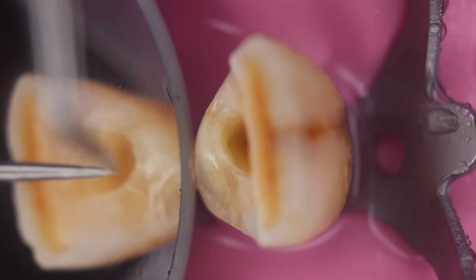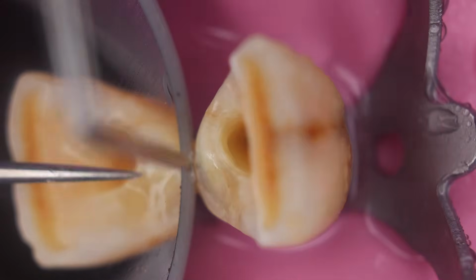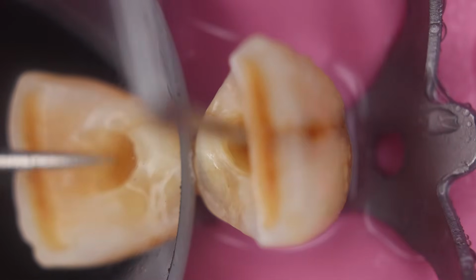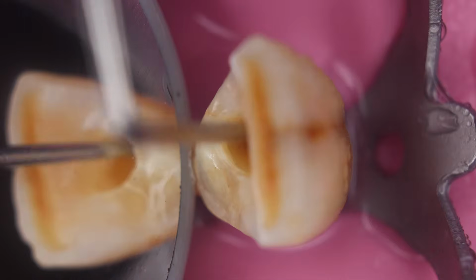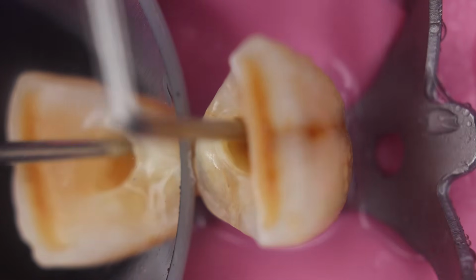So this is the shape that we have obtained with the broader base at the incisal edge and the apical end directed towards the root.